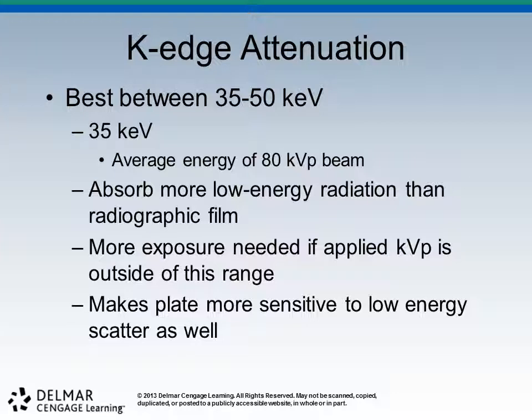So much below 80 kV, or much above 110, 120, and we're outside this best range here. It does, by the way, make the plate much more sensitive to scatter.